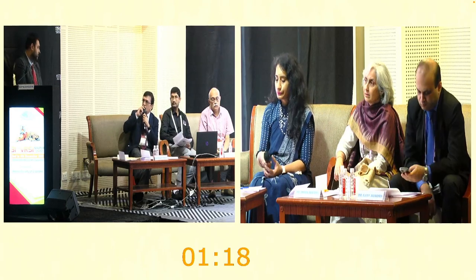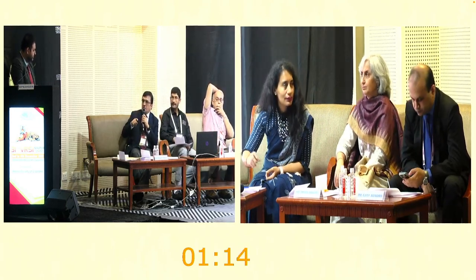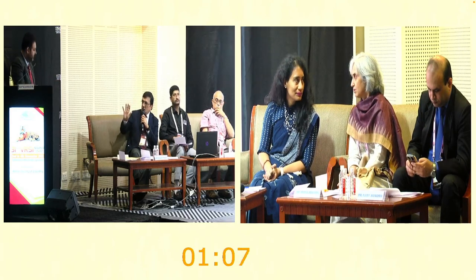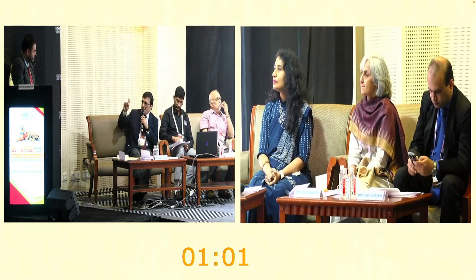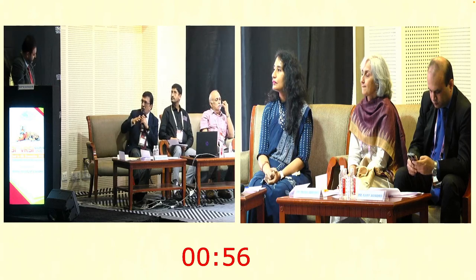I have a question for you, Mohit. So the driving force for your passive is infusion of the system. Just one second. It's the infusion of the system, which means you have to have that much of a fluid column coming into the needle, come into the syringe. Absolutely. Your retina was virtually dry. Yes. This fluid could also be coming from the vitreous, actually.